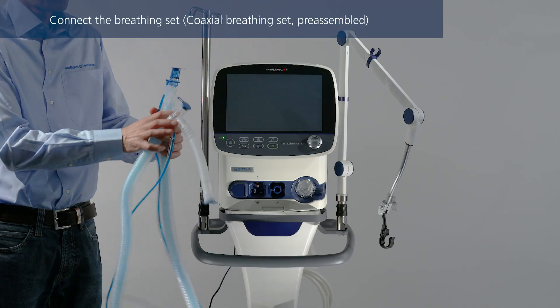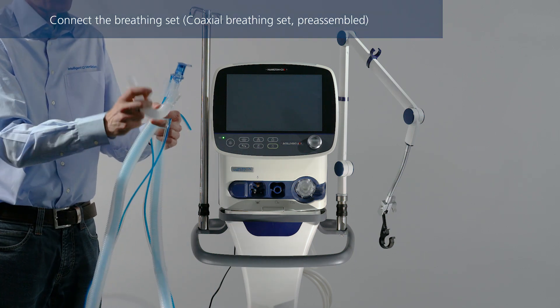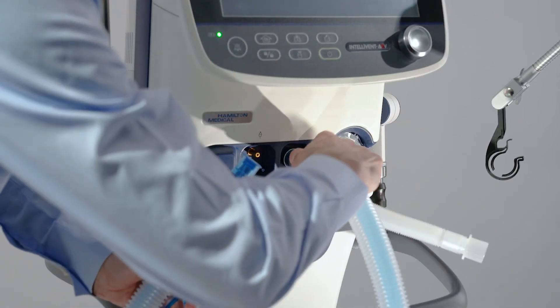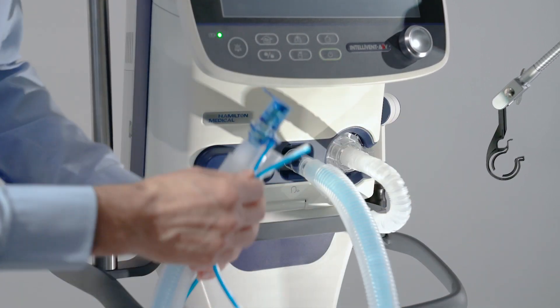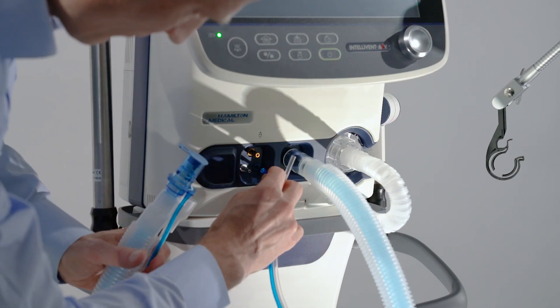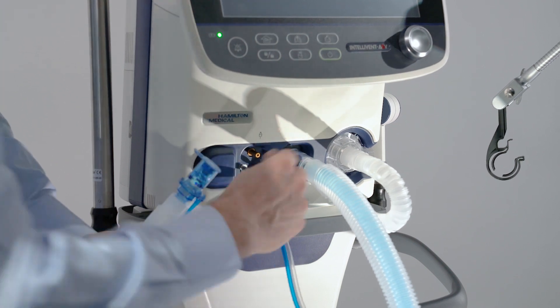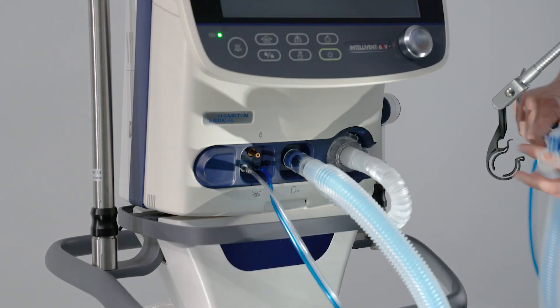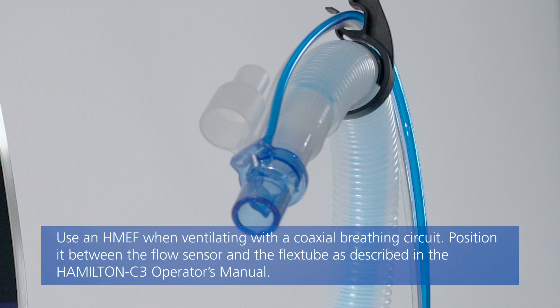If you are using a coaxial breathing set with the proximal flow sensor, to prevent water accumulating in the flow sensor and tubing: first, connect the main tube to the inspiratory port on the ventilator. Then connect the expandable expiratory tube to the expiratory valve. Finally, attach the blue and clear tubes to the flow sensor connection ports on the ventilator. Position the flow sensor tubing on top of the flow sensor.